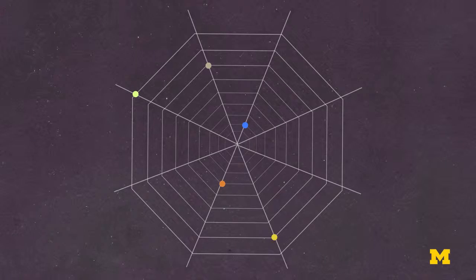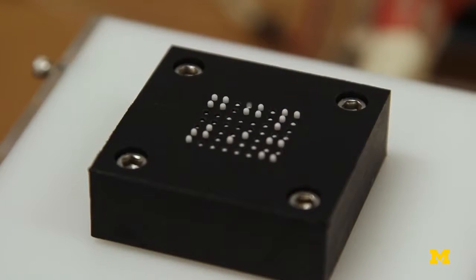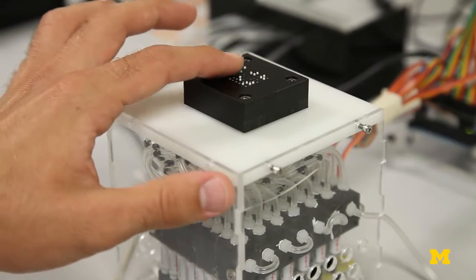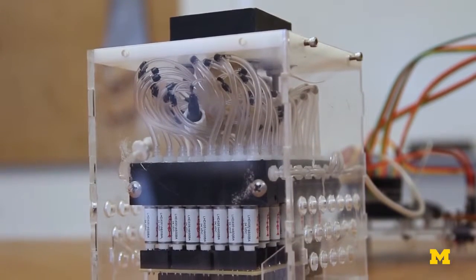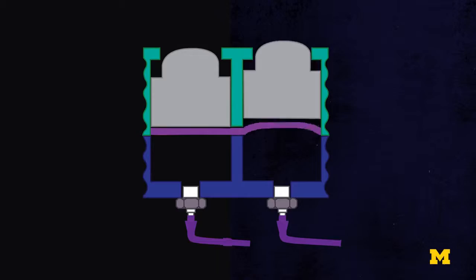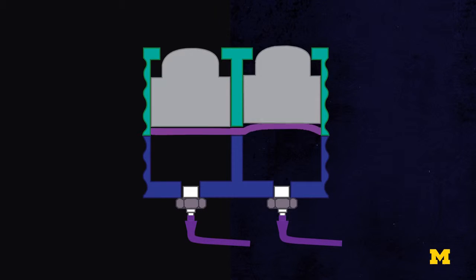So what we've done is we've created the same dots that are created with these old displays in a new display format. One of the advantages with our display is that it's entirely pneumatic, which means that we can either drive it with air or fluid. In practice, what that means is we have a series of bubbles which are either inflated or not inflated, and those bubbles in turn push dots up and down.